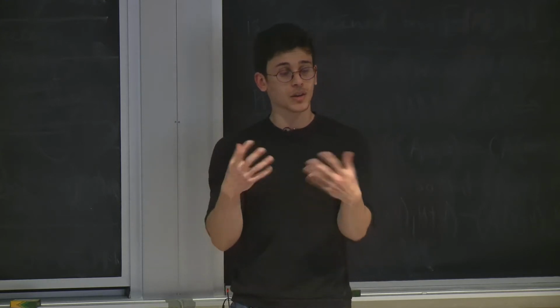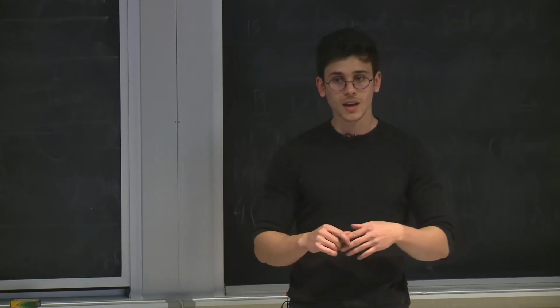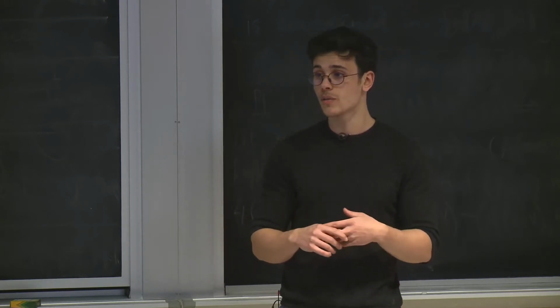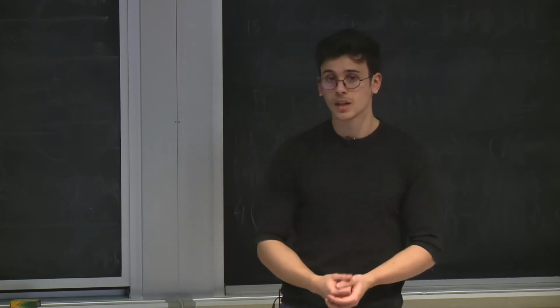And so you can have things like a Tyrer-Cuzick model that is worse than random and explicitly harmful for African American women. Guarding against that, you can do a lot based on first principles, but some of these things you can only really find out by actively monitoring to say: is there any subpopulation that I didn't think about a priori that could be harmed?